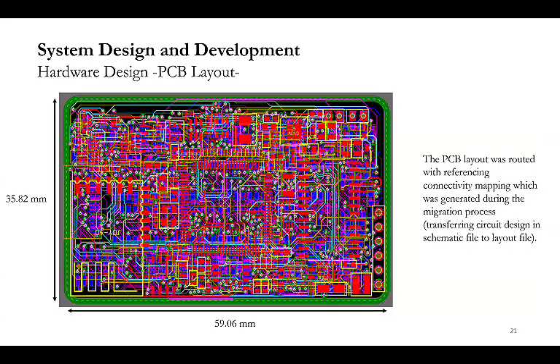After we got the PCB, you see the bare fabricated PCB on the left. Then we ordered all the components from certain electronic distributor companies. And then we had a precise soldering station with a 1 mm tip size.